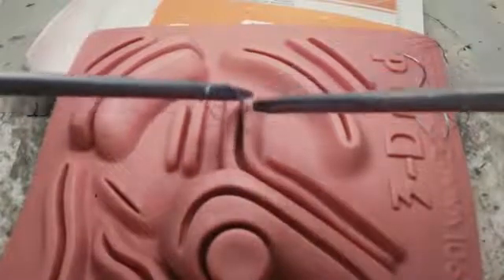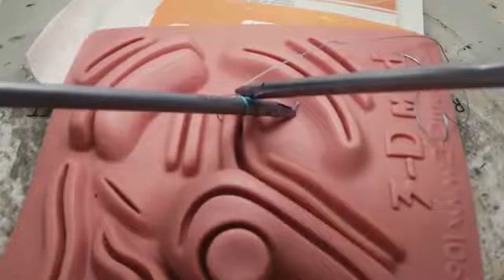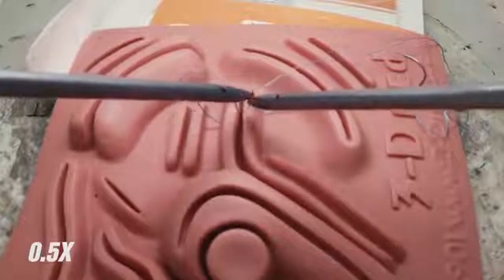Working directly over the knot also increases your length of working suture. Rotate the loop by supinating. Now you want to rotate the loop back down toward the tissue by pronating, and this will create your first throw.